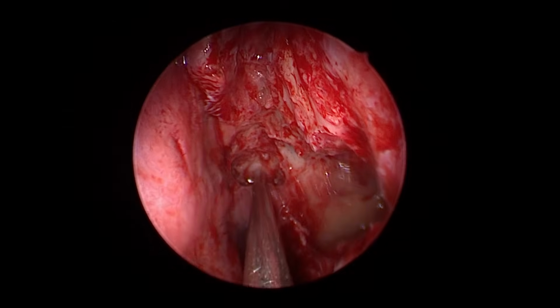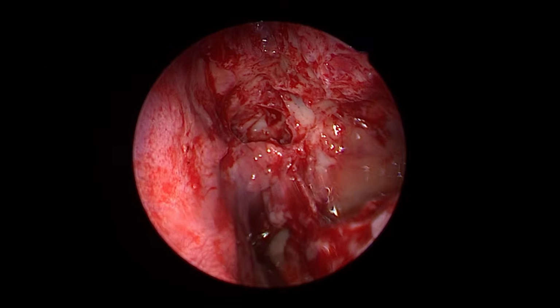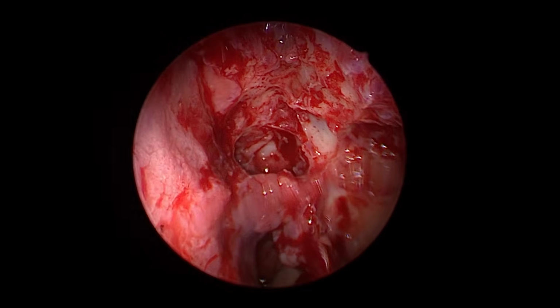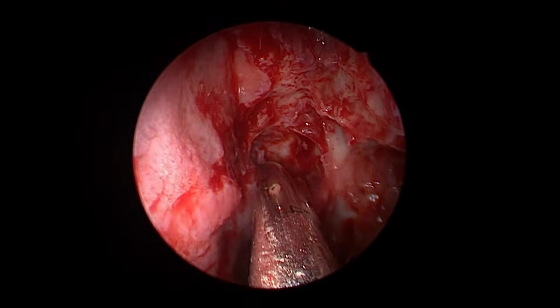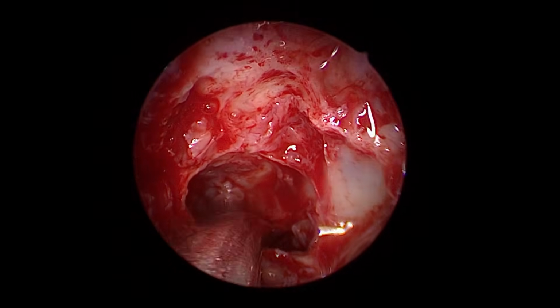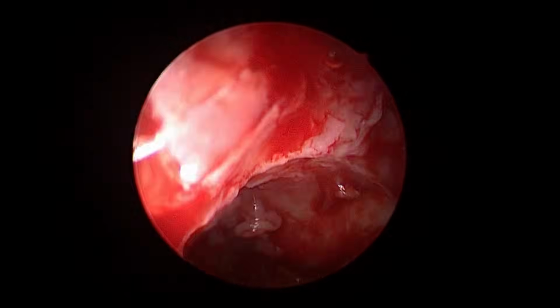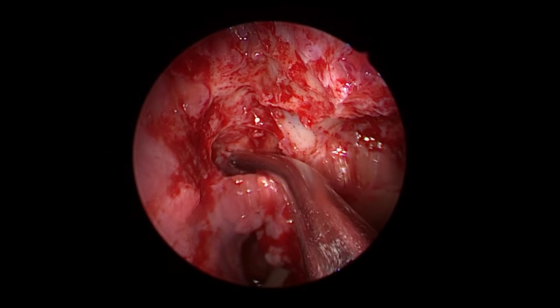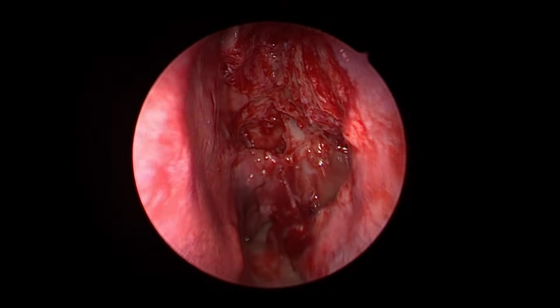Do we need to lower this anterior wall of sphenoid more? No, not really. Why? There is no massive disease inside. In case of massive disease inside, you may have to elevate the periosteum and drill it away or punch it away. See this? The sphenoid is quite good. No need to do anything unnecessarily. Anything else you want me to show on this side?